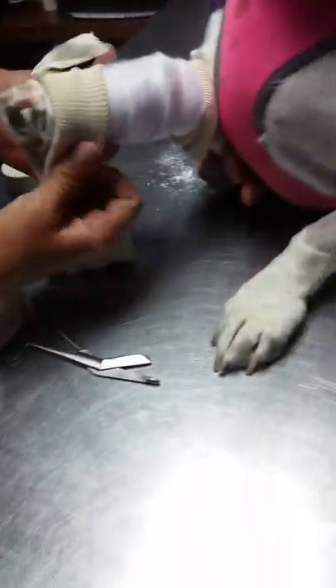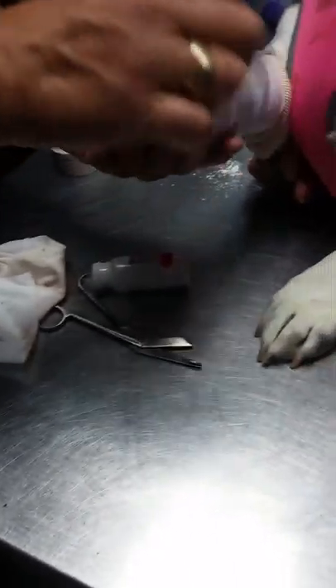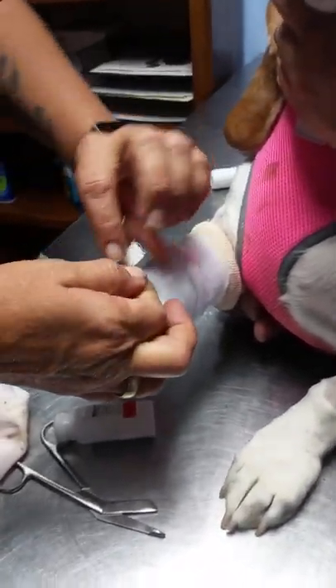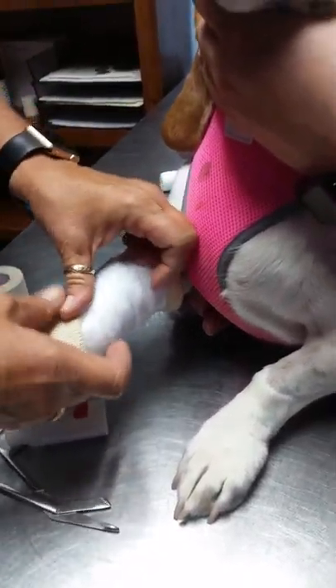We're just going to flip this onto itself to give her her little toes, then take the end of the stirrup, twist it, and stick it onto itself.